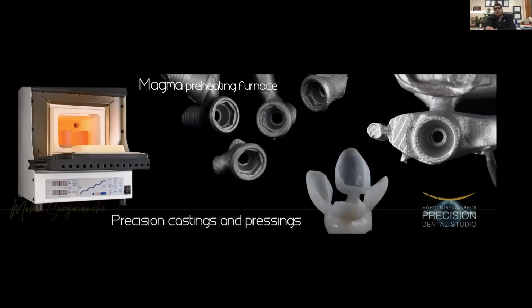Whenever there is a 3D printed restoration, there are casting failures or pressing failures. I get a lot of calls from all across the country. I try to tell them this is the reason, because we are not following the heating stages. So you need to have a programmable furnace which gives you the possibility of heating your investment ring in various stages. You cannot just put the ring into a very hot furnace like you used to do with the wax. When it comes to precision castings and precision pressings from 3D printed resins, you need to follow all that.